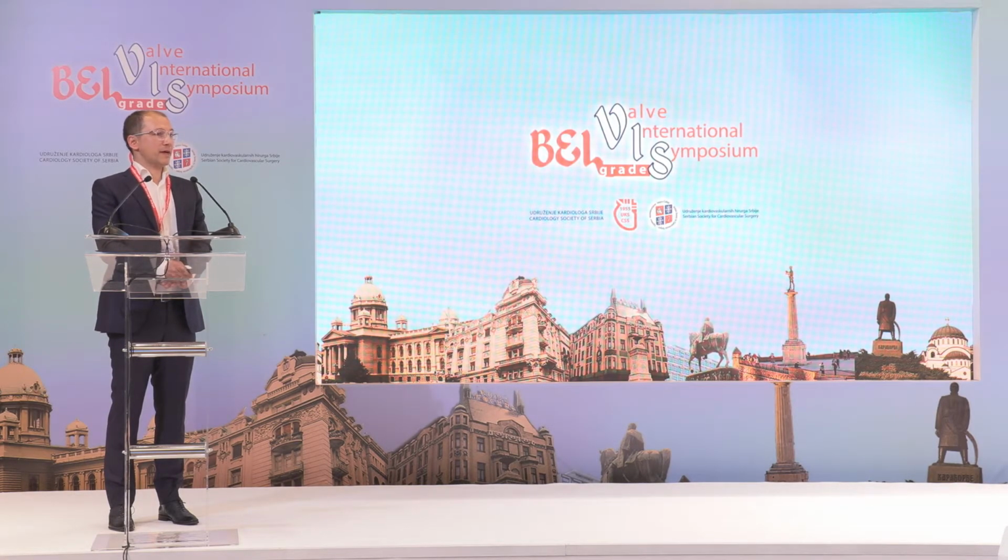But I am a fan of His bundle pacing and conduction system pacing, and in patients where they can correct QRS duration, interventricular conduction delay, or bundle branch block, we can expect to have responders also regarding secondary mitral valve regurgitation. We don't have clinical data regarding that, and we are waiting for them.